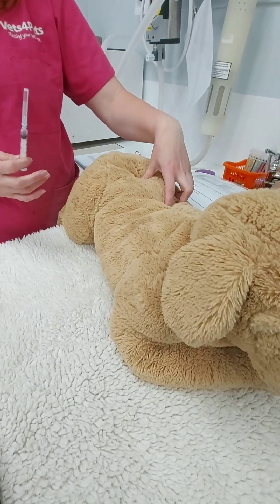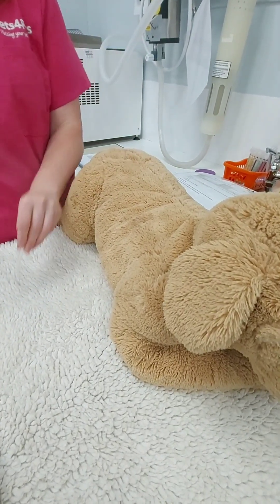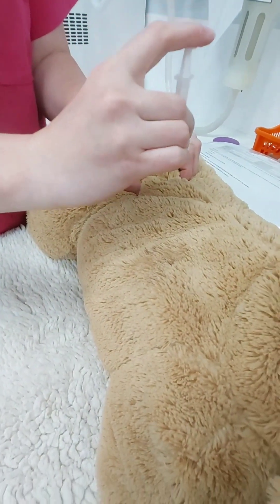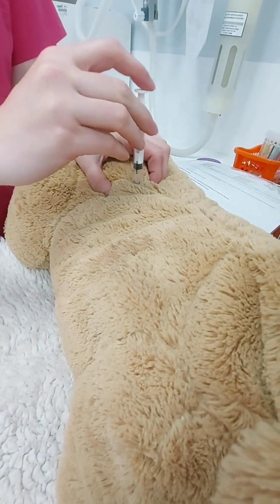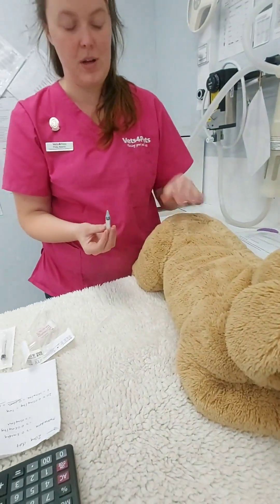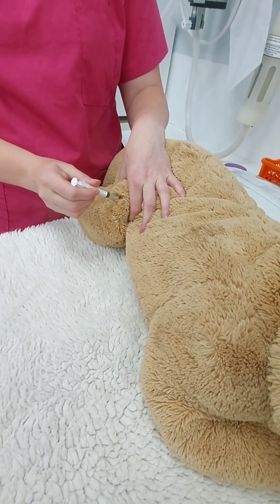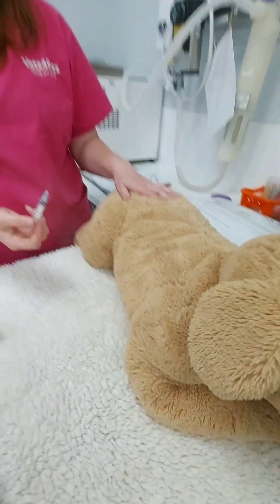If doing the lumbar, we have our fresh needle ready to go. Remove the cap, pinch the muscle, tap on the muscle, insert at 90 degrees, draw back, no blood, inject. That's the lumbar muscle. The same would apply for the quadricep: remove the cap, pinch the quadricep, locate the muscle, 90 degrees, draw back and inject. Either one is appropriate.